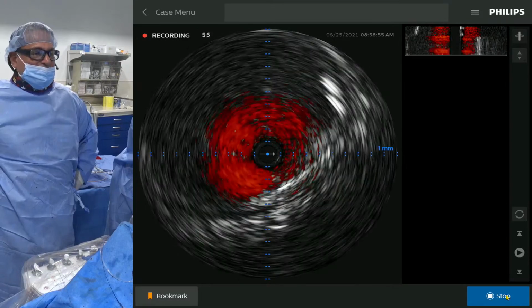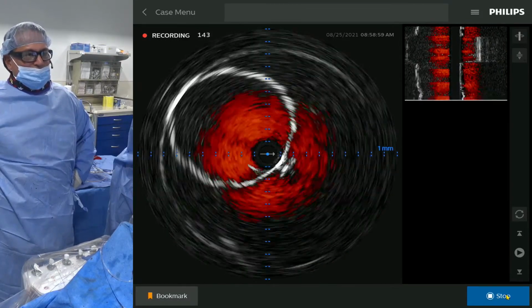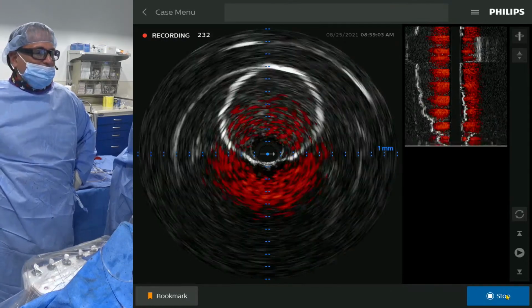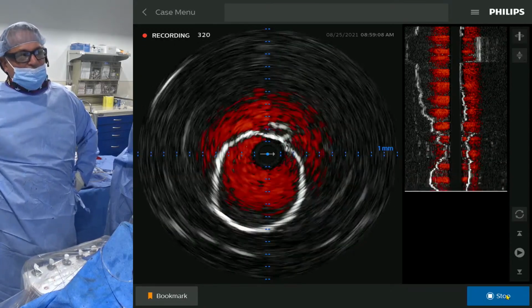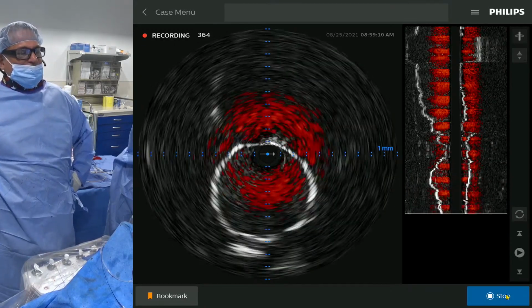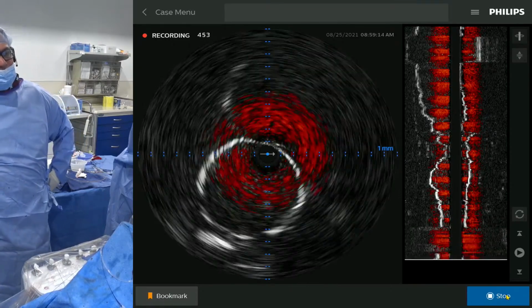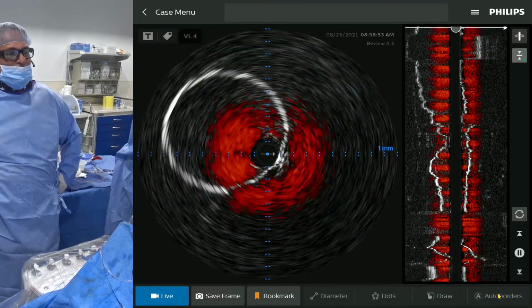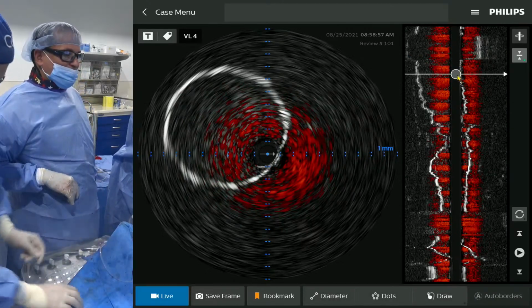It's not a true aneurysm. You just have post-stent dilatation of maybe 3 millimeters, so we're never going to expand it. So the idea here would be to put another coverage stent across, or leave it. Let's pass an 035 wire through. If an 035 wire goes through without a problem, then we know that we don't have to post-dilate this.